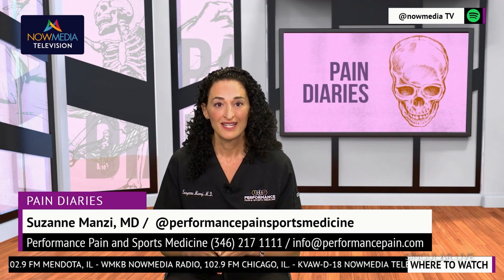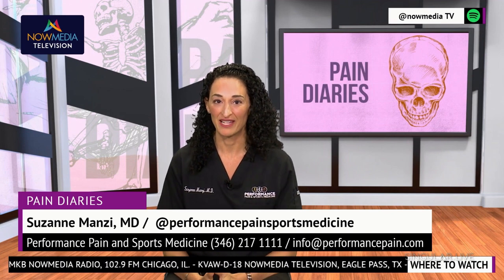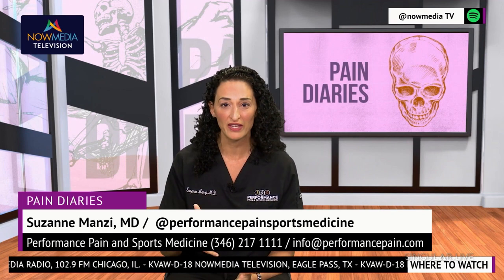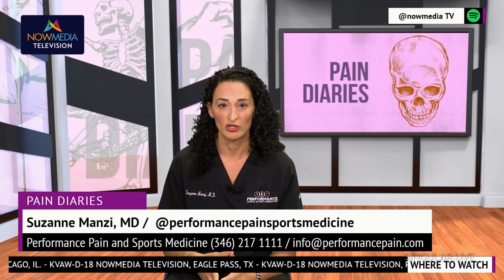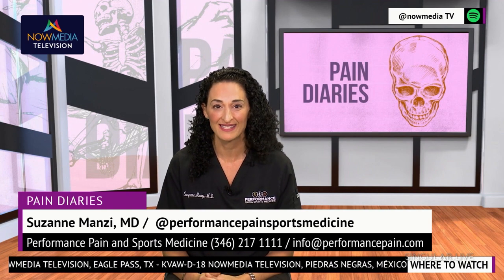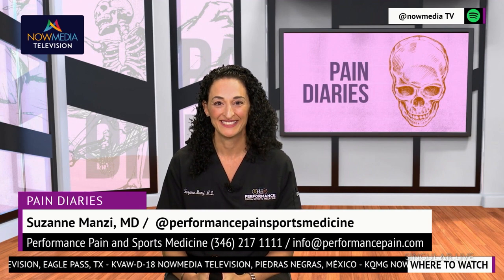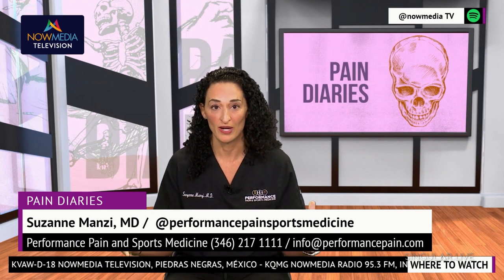Spinal cord stimulation can be used to treat various conditions that cause chronic pain, such as neurologic pain, neuropathic pain, complex regional pain syndrome, failed back surgery syndrome. It's also commonly used to treat chronic pain in the arms and legs and other areas of the body. The benefits of spinal cord stimulation are numerous.